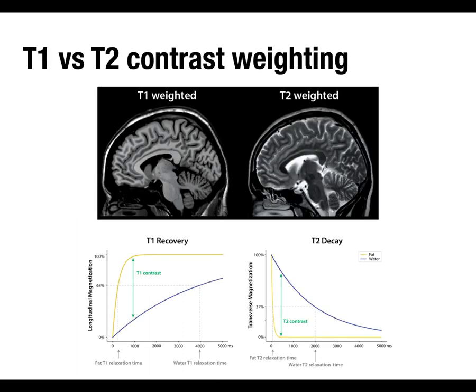And that's basically how we get an image. What we haven't talked about yet is how you get a 2D or 3D image. All we've talked about so far is you send RF pulses in, and you record some energy, and as I showed you, the receiver coil signal is just like an oscillating sine wave. It's not a brain. So there's obviously more that we have to do.